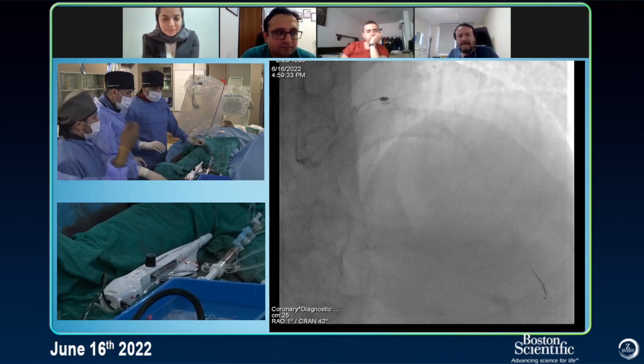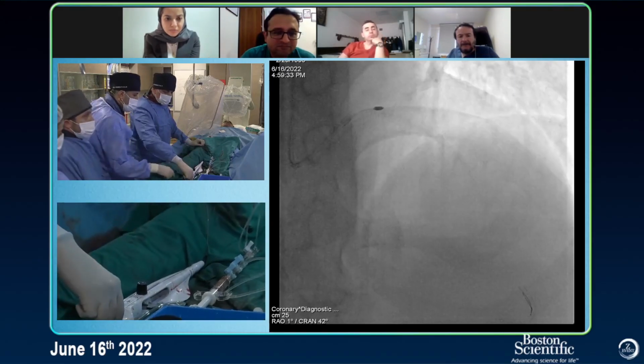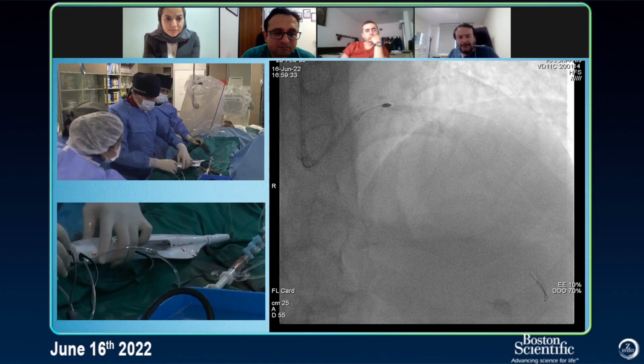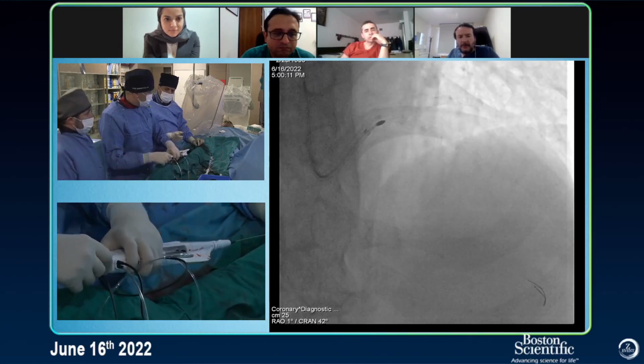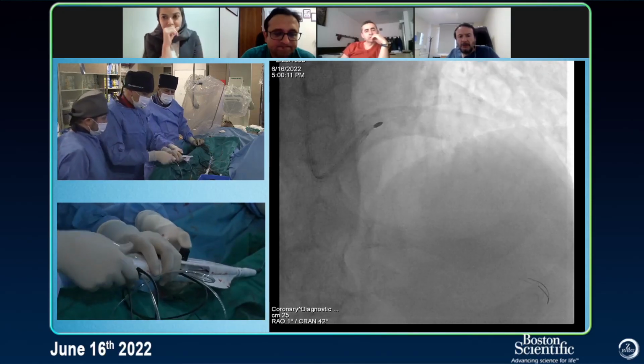Right, thank you. Let's go again with the dynaglide mode. We will remove it by pushing the wire. I'd like to show you how we do it. The Y connector should also be opened. That's another important thing. Press it, please.